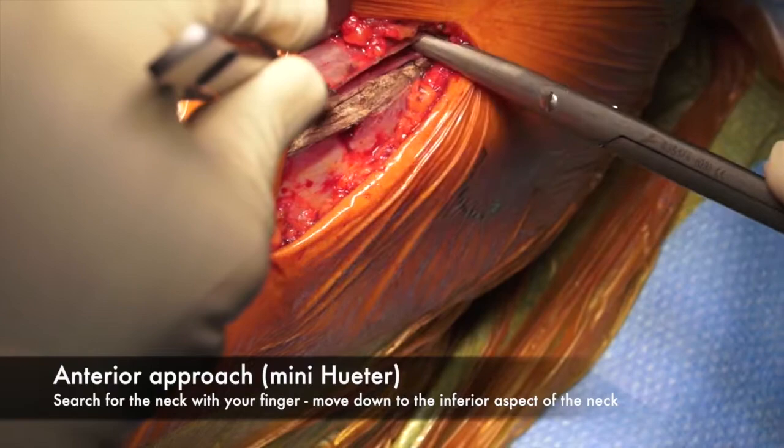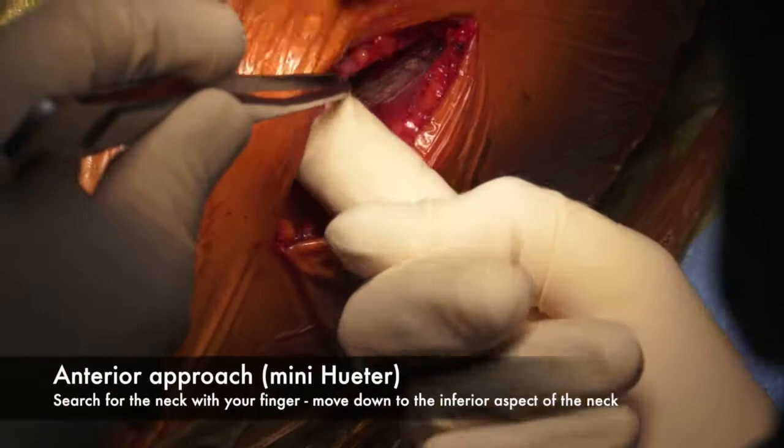4. Search for the neck with your finger. Move down to the inferior aspect of the neck.